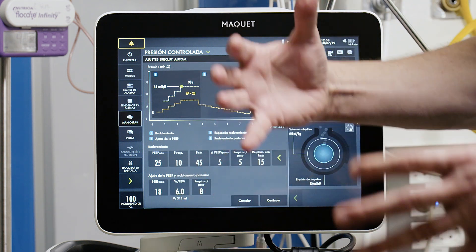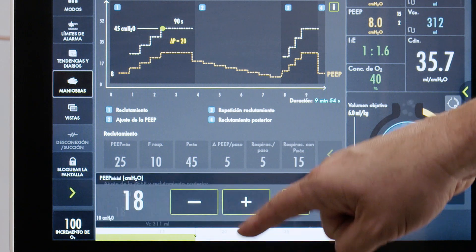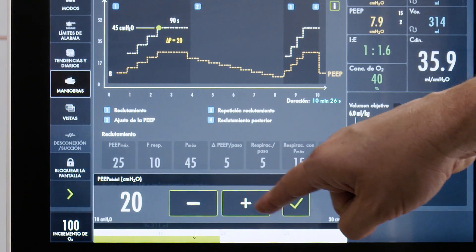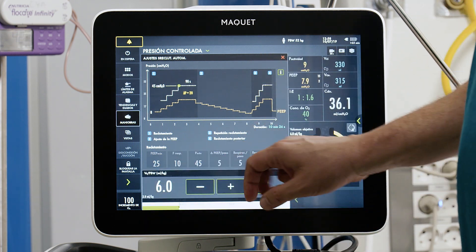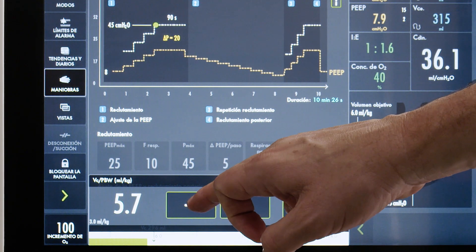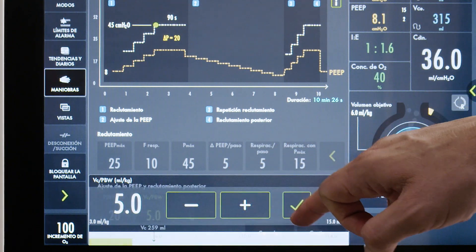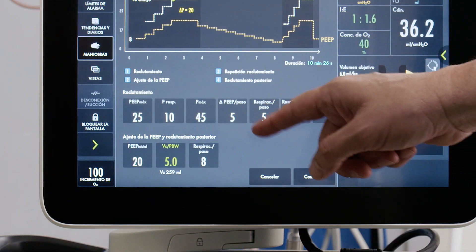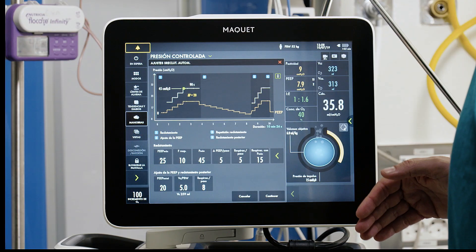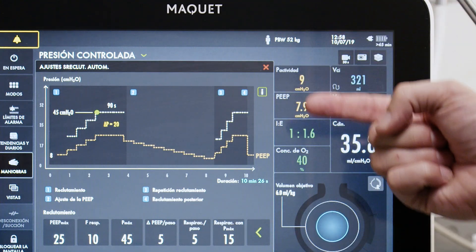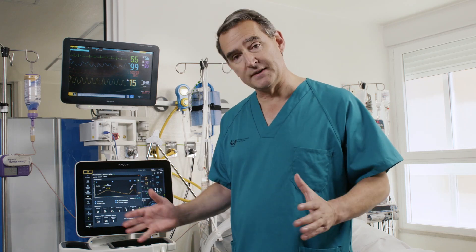Next we set the parameters for the decremental PEEP trial. The starting PEEP level for the decremental trial is 20 cmH2O. We select a tidal volume of 5 mL per kilogram, since during this phase the ventilator switches to volume control, in order to minimize errors in compliance determination and avoid underestimating the closing pressure. We also set 8 breaths to spend at each decremental PEEP step.